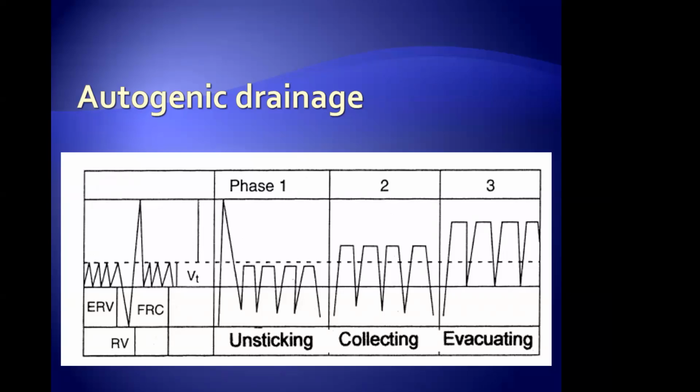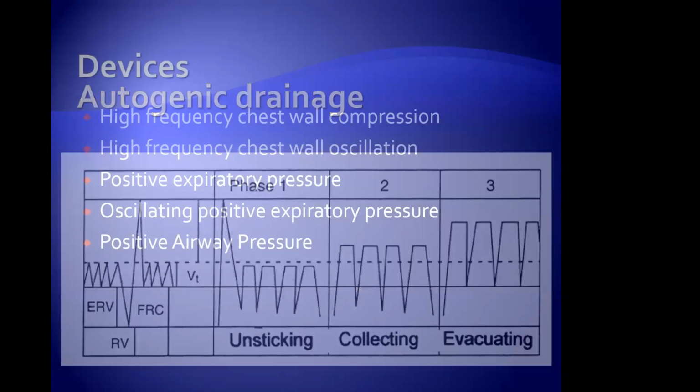And again, where does gas exchange take place? FRC. I want to increase my FRC. I want to have a higher level of FRC so my patient is like, yeah, okay, I'm getting that.